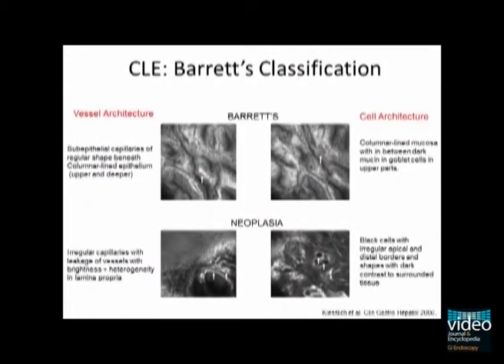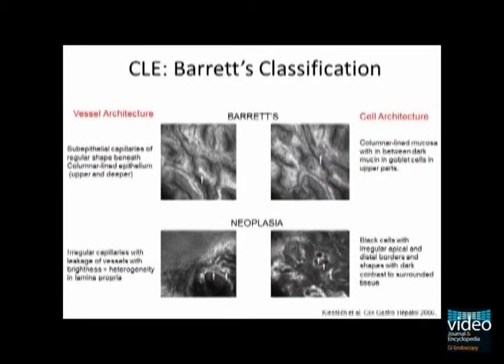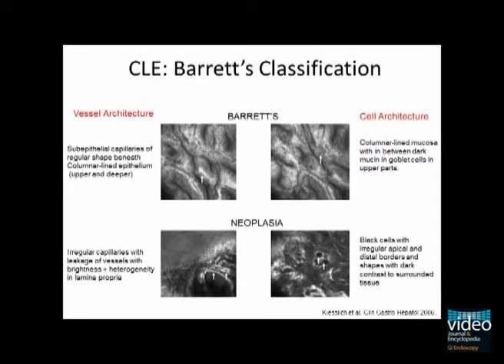To distinguish between benign and neoplastic mucosa, the original classification by Kieslik and co-workers uses features of vascular and cellular architecture of the esophagus. In normal Barrett's mucosa, subepithelial capillaries have a regular shape and a columnar-lined mucosa with in-between dark mucin and goblet cells is found.